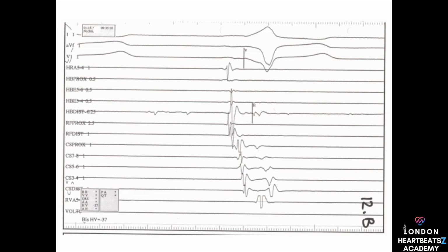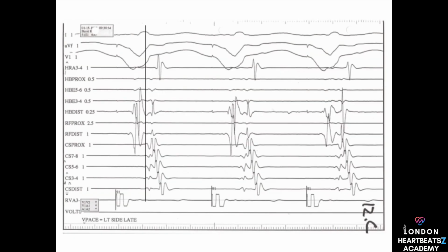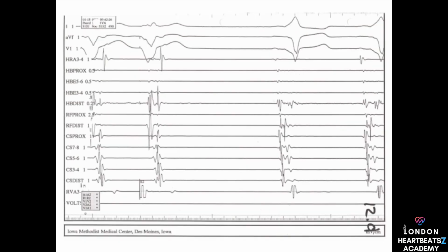Figures 12B and 12C, those are just showing that same pre-excitation pattern at different speeds and during ventricular pacing. Right, and notice that during the pacing, the earliest atrial activation is still happening at the His bundle. That confirms it's a right-sided pathway. But now the high right atrium is showing the latest atrial activation, and the left-sided coronary sinus electrograms are delayed too. So pacing really helps us visualize how that signal's traveling. It does. Now, figures 12D and 12E, those are showing ventricular extrastimuli, and the shortest VA interval is always at the His bundle, confirming that right-sided pathway again. Okay, so more confirmation of the pathway.